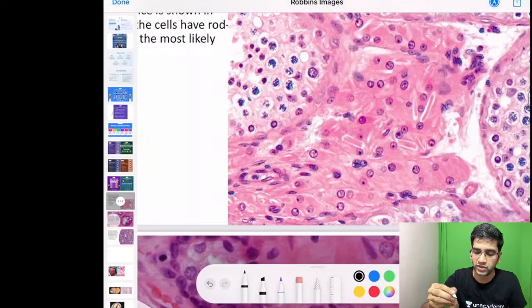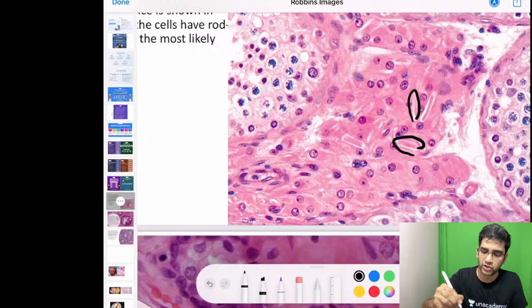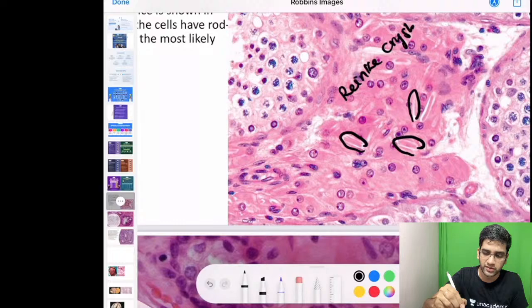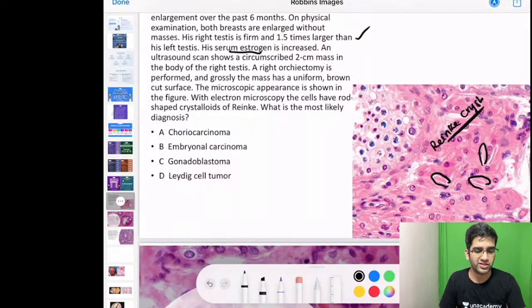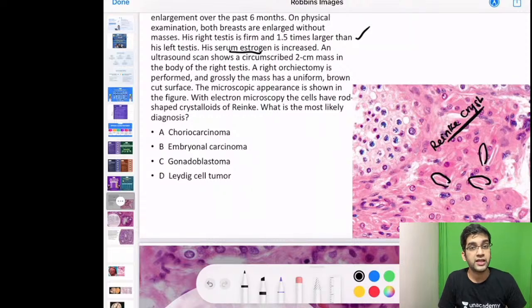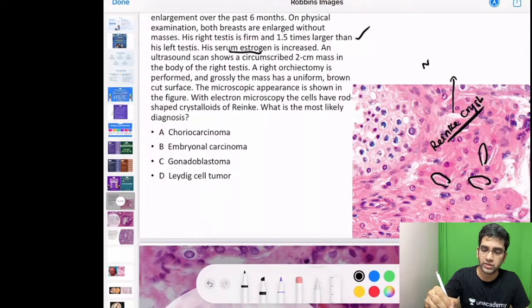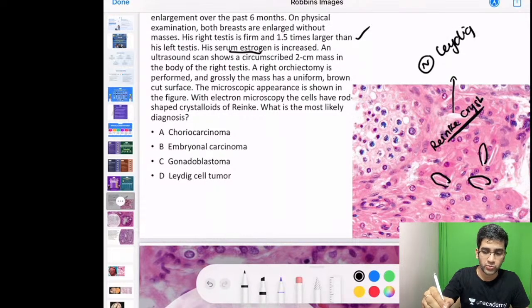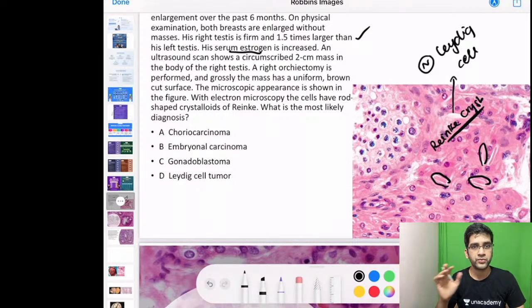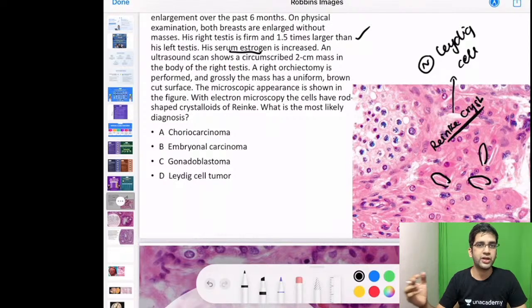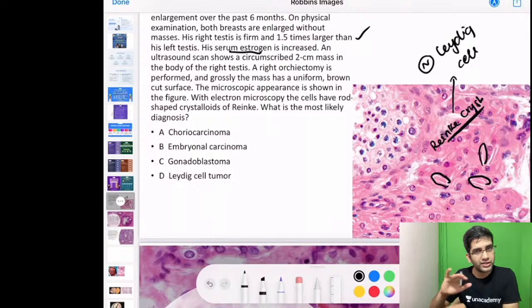The microscopic appearance shows rod-shaped crystals — these are Reinke's crystalloids — which are very characteristic. With electron microscopy, cells show rod-shaped crystalloids of Reinke. Reinke's crystalloids are seen in normal Leydig cells too, not only in Leydig cell tumours. So the finding alone doesn't make it a tumour; you need the history of a hormone-secreting lesion plus Reinke's crystalloids.